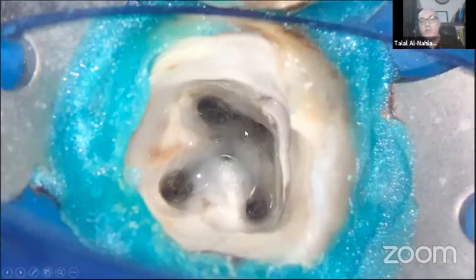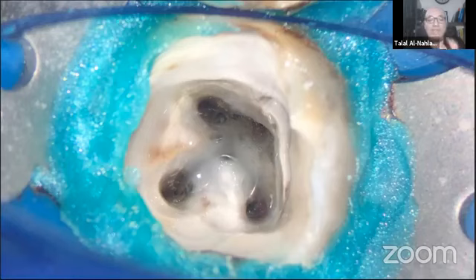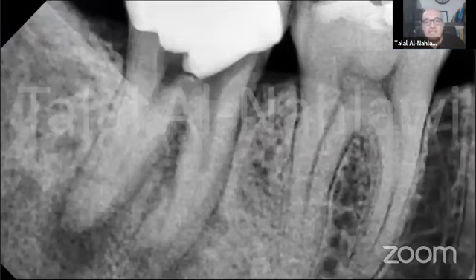And then, of course, I will keep putting these slides, because the most important thing is to have the disinfection to clean our root canal. We will not be here, like Dr. Mohamed said, okay, we want only to remove a broken file. We want to remove a broken file or to bypass a broken file in order to gain more disinfection of our root canal. So don't forget the role of disinfection and activation after removing or after bypassing the broken file.